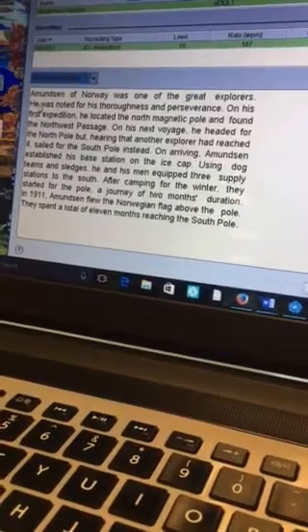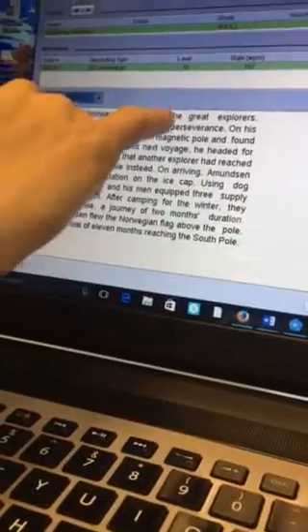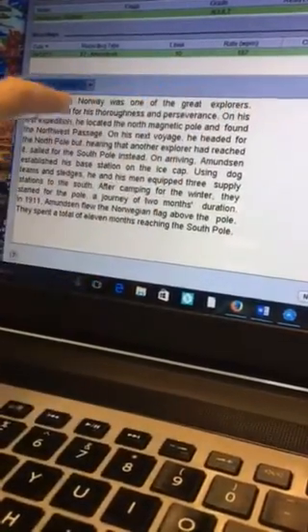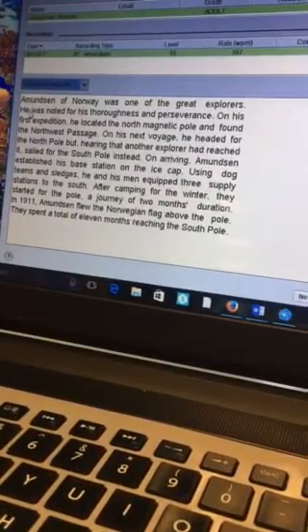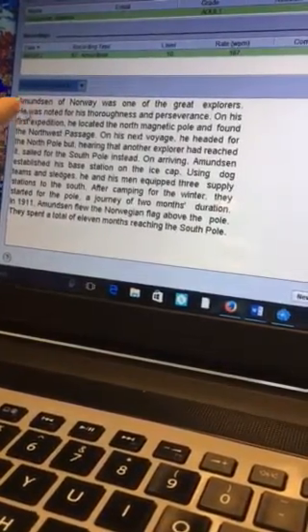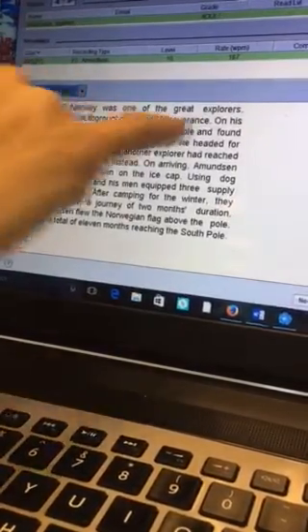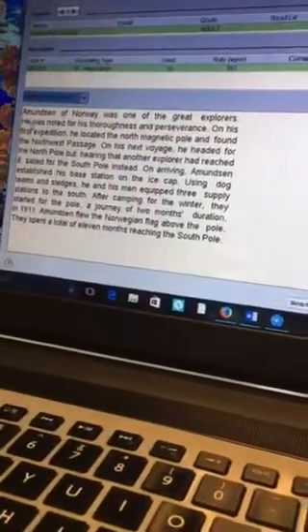What we want to see in a reader is that your eyes pause about every 7 to 9 letters as you move through the passage, and we want to see that when you go from the end of one line, you go directly to the beginning of the next line. You don't typically land on the very first letter. Most readers are going to land about 3 letters in, but I look for that consistency, so each time you land on the next line that you're landing in the same place, not jumping and skipping and inconsistent with those movements.